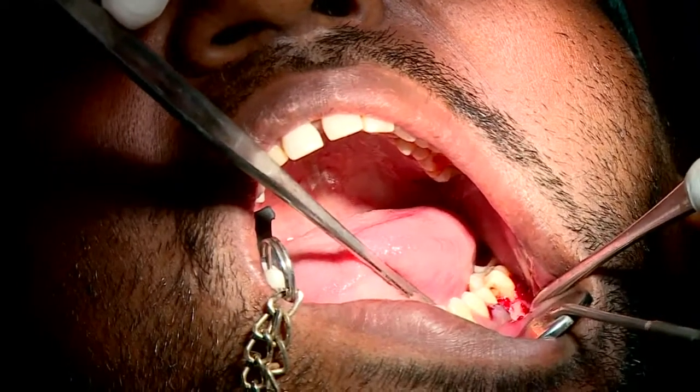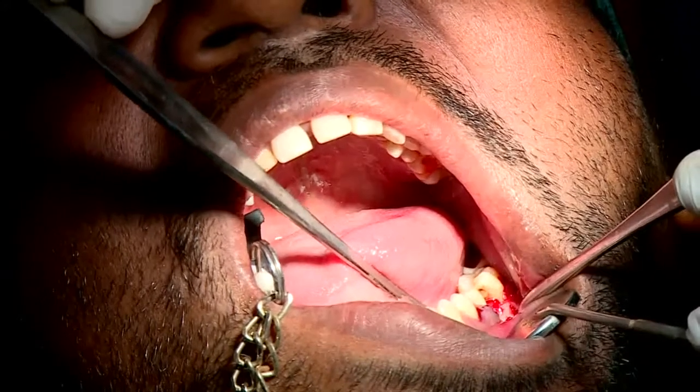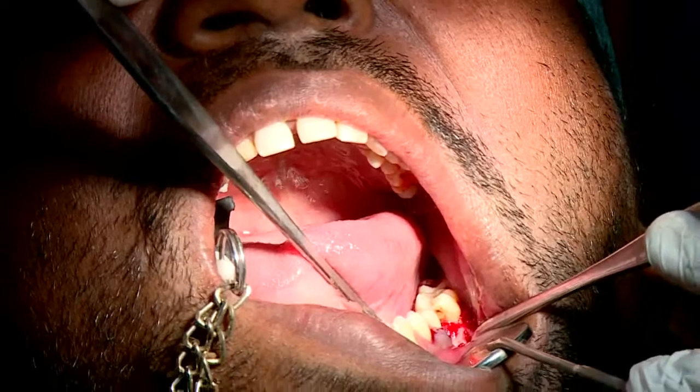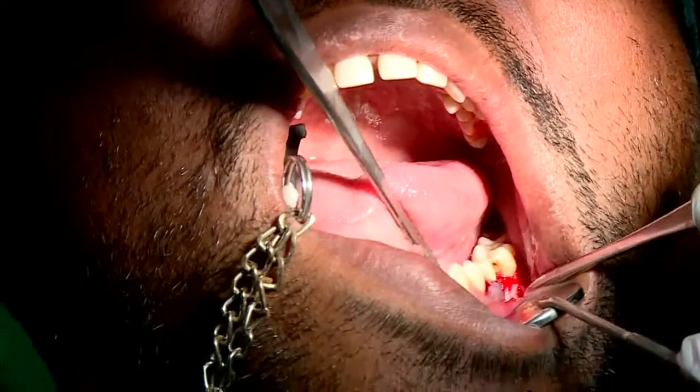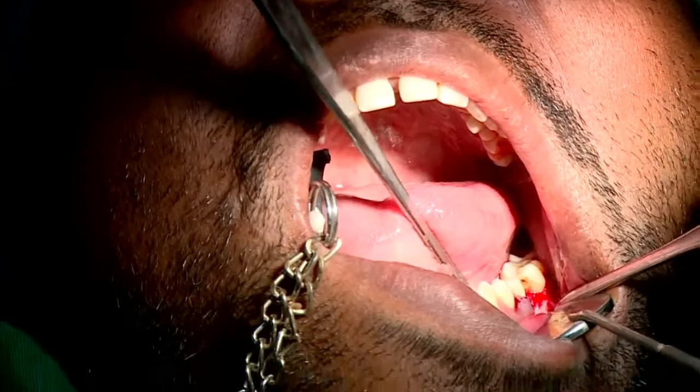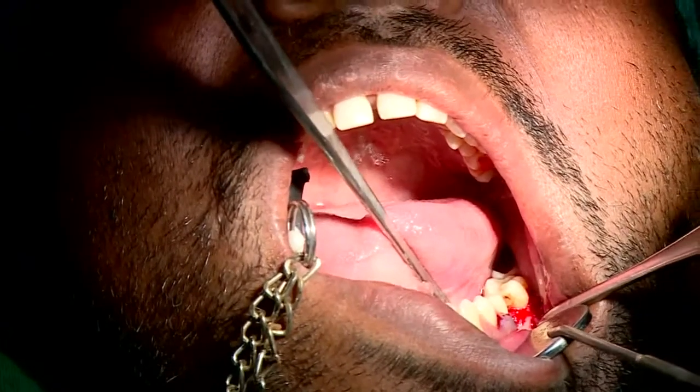Then another thing they talk about is immediate loading. Immediate loading means that you give a tooth immediately. Now I tell my patients, like Dr. Yasser said, I do a lot of implants, but I tell most of my patients, I am sorry, I belong to the old age group.